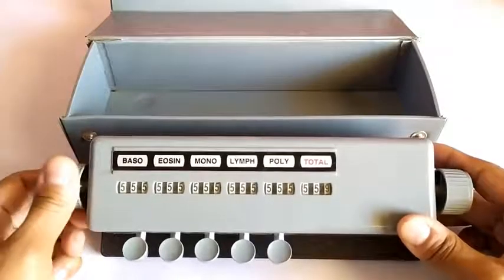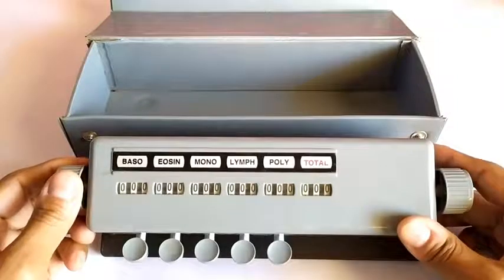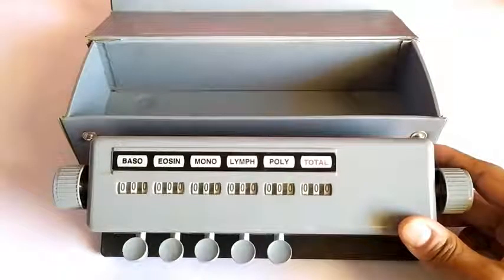When a counting session is complete, you can set the counter back to 0 by rotating the 2 knobs located on each end of the counter in a clockwise fashion, until the rotating numeral rings of each slot are at 0. In DLC count, 100 cells are usually evaluated.